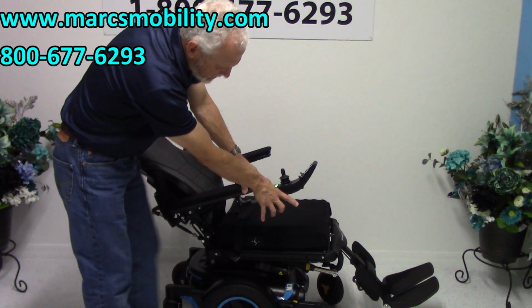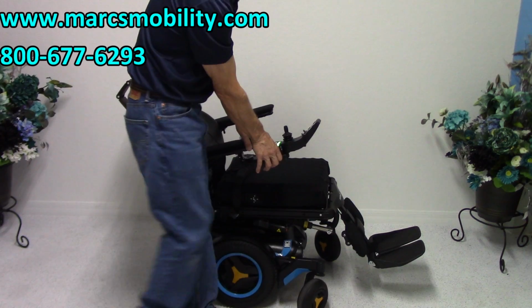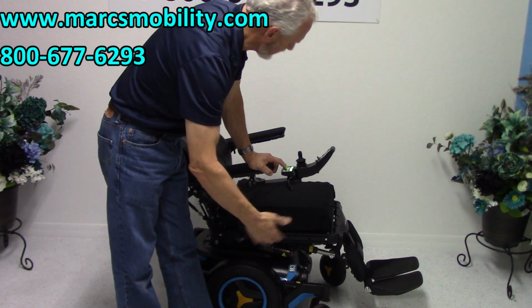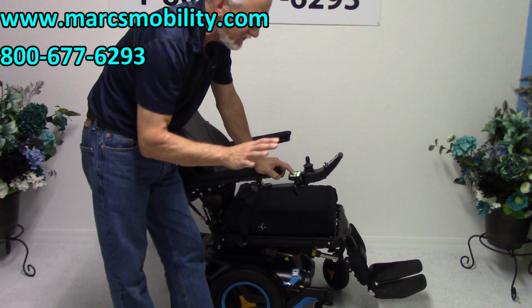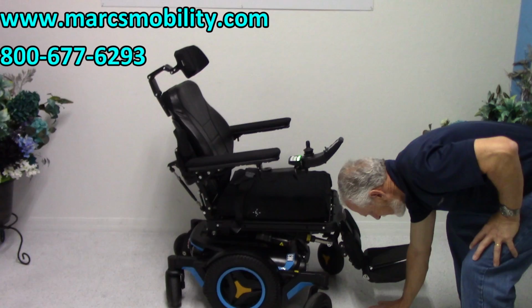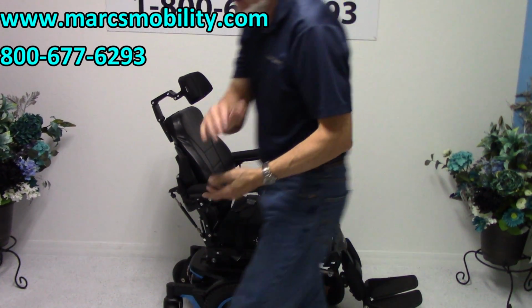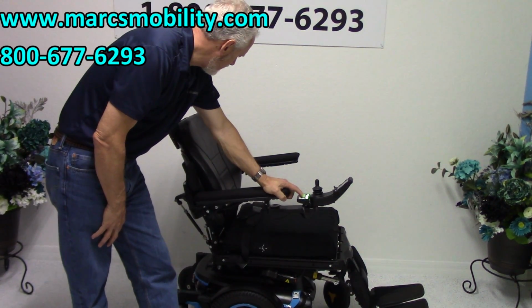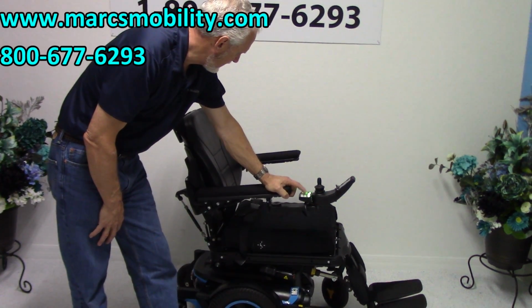If you're outside, make sure you leave your legs out like that. These are set up pretty high already, so there's a lot of ground clearance, but sometimes we have chairs where people are 6'2", 6'3", and the legs are all the way down to here. You don't want to ram into a sidewalk and damage the electric legs. That would be very costly.